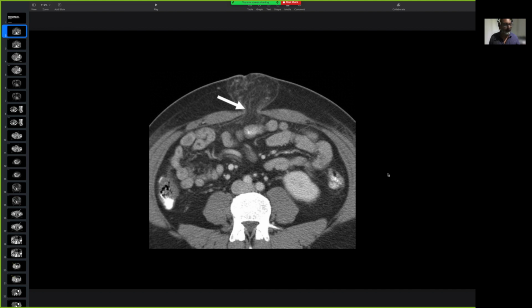Okay. So it's a hernia, and it's a ventral hernia. It's coming through the linea alba. It could be an umbilical hernia. I think I wrote umbilical hernia for it, but actually I'm not sure. I quickly wrote it, but now that I think about it, I don't know if it's at the level of the umbilicus. So it may not be an umbilical hernia, just maybe a ventral hernia right anteriorly. But you know where the hernia is. It's coming out of the linea alba. So there you go.